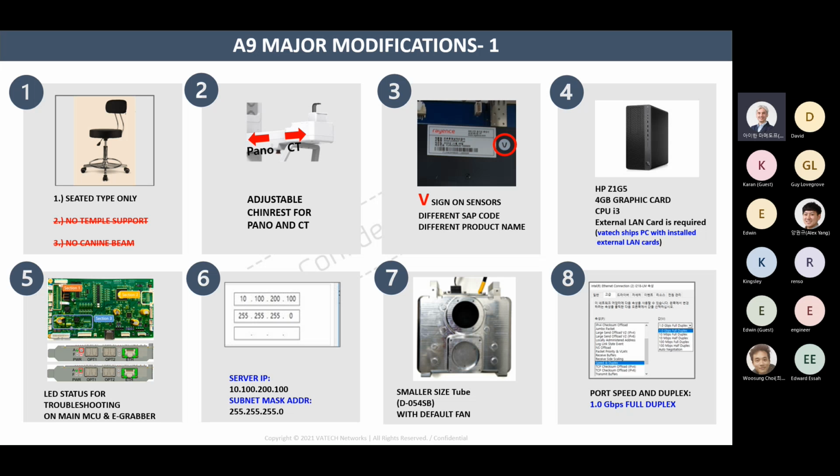And also we changed the server IP, as I explained. The server IP before was 195, etc., and it created some conflicts. That's why we changed the IP to this.